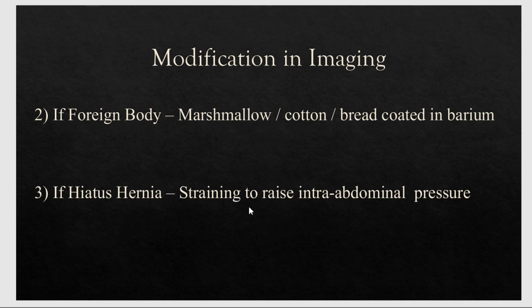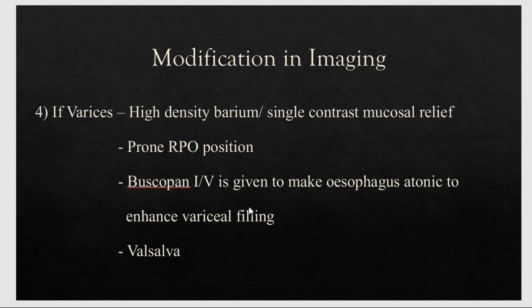If we are suspecting hiatus hernia, we usually ask the patient to strain to raise the intra-abdominal pressure to amplify the hiatus hernia, to clearly diagnose it or have a clearer picture of it. So straining is important in case of hiatus hernia.